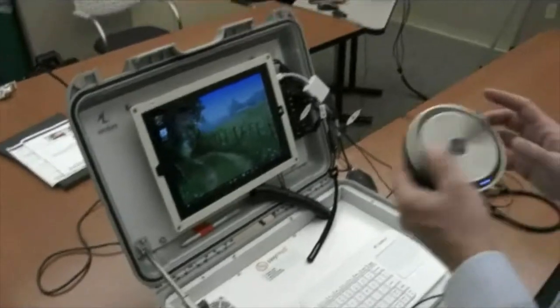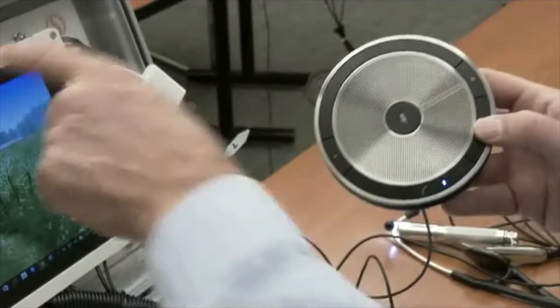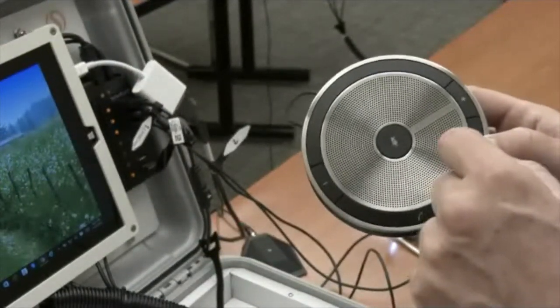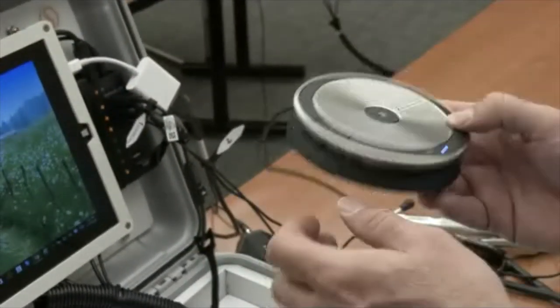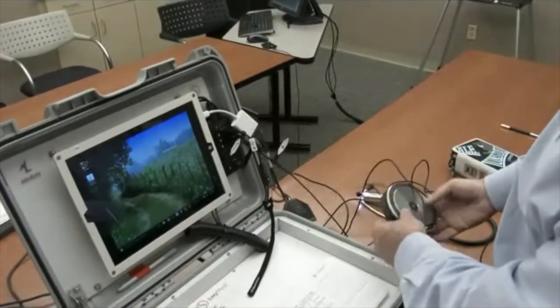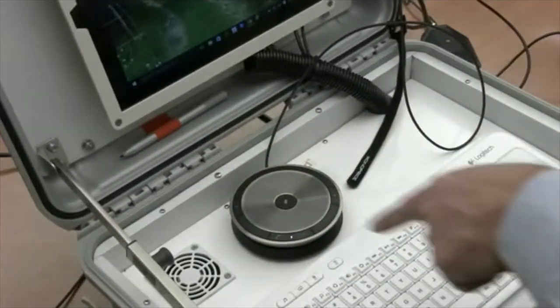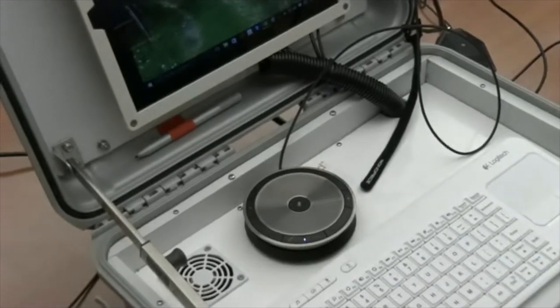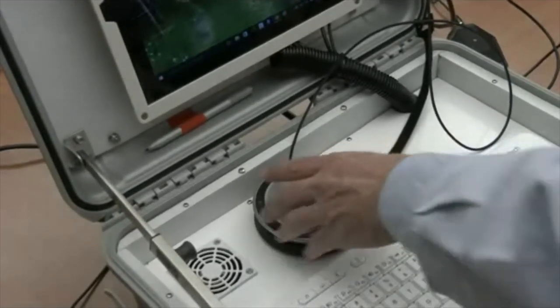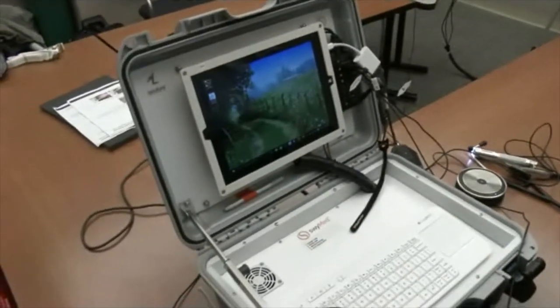So those are all the things that we have. We also have a microphone. The microphone has a button at the center where you can mute it, but you can also mute it from the interface. We recommend not putting the microphone inside the case, because otherwise sound will bounce on the corners and sides. Put it outside the case, not too far away from the person speaking.